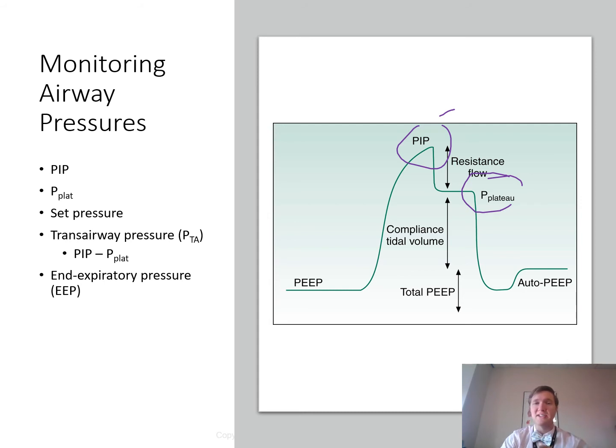And the duty cycle is I time over total cycle time, right? And that's going to be one of your big things, I time over total cycle time. And then your frequency. Inspiratory flow patterns and modes can influence this. So one of the things that we have to look at is monitoring mean airway pressure can be useful when looking at the benefits and side effects of positive pressure ventilation, because it closely parallels alveolar mean pressure, right?